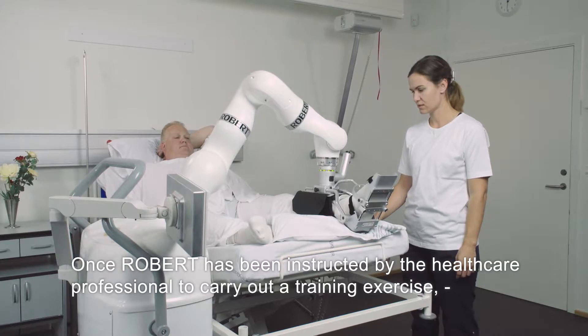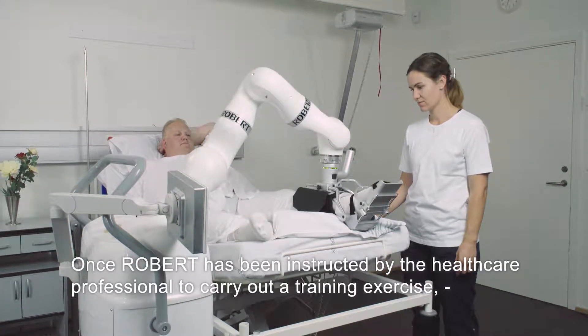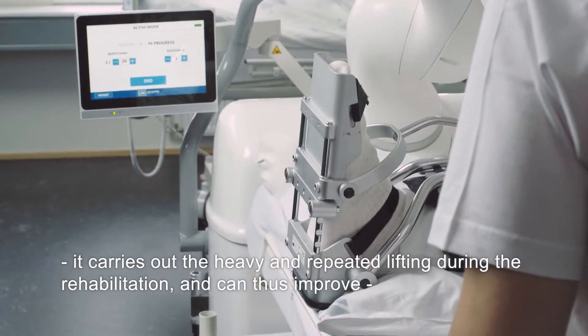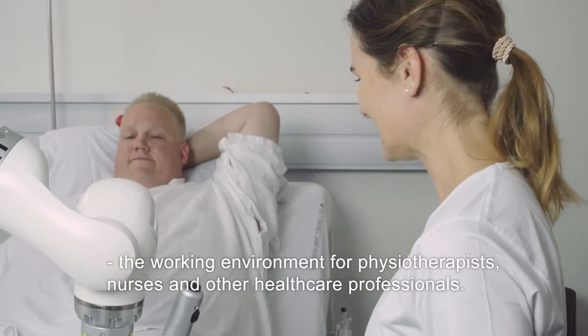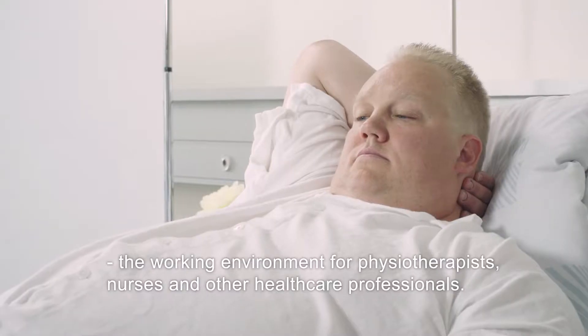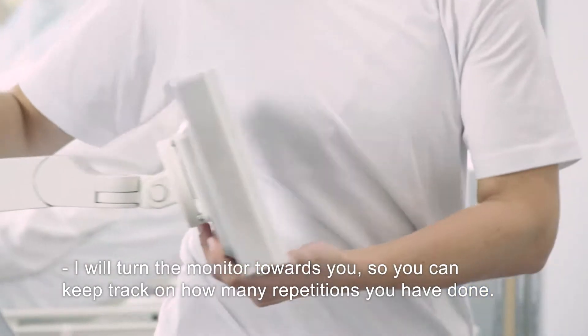Once Robert has been instructed by the healthcare professional to carry out a training exercise, it carries out the heavy and repeated lifting during the rehabilitation, and can thus improve the working environment for physiotherapists, nurses and other healthcare professionals.